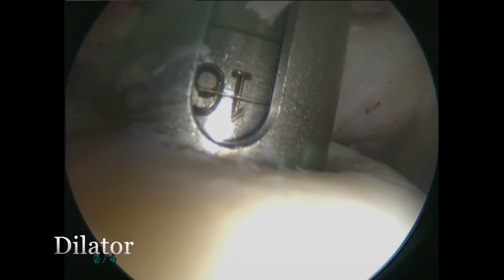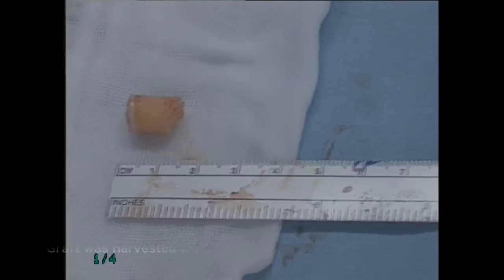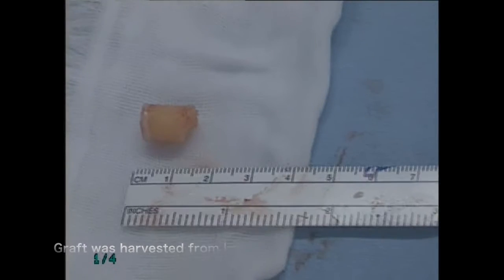The dilator was inserted into the drill guide and tapped to the desired depth.